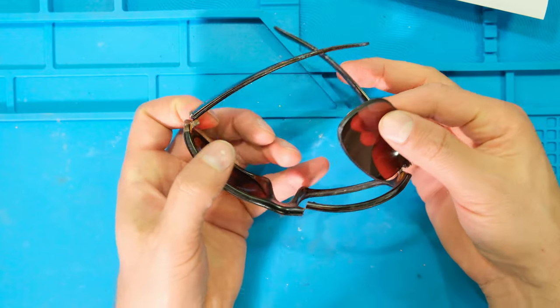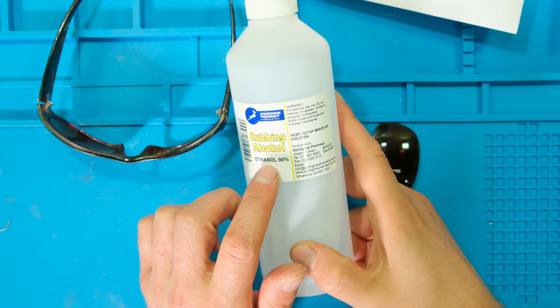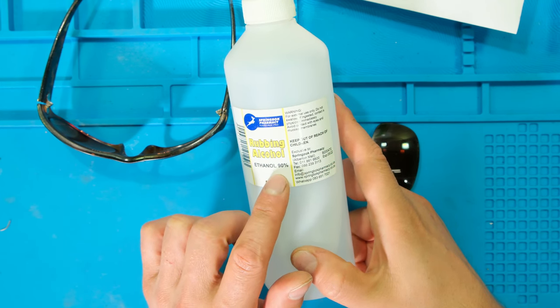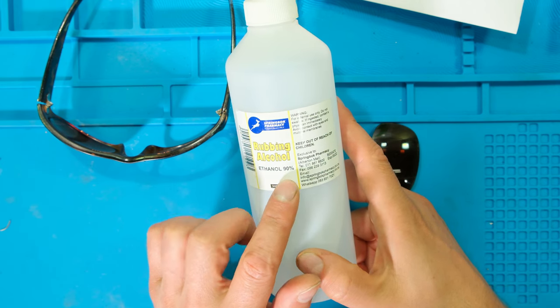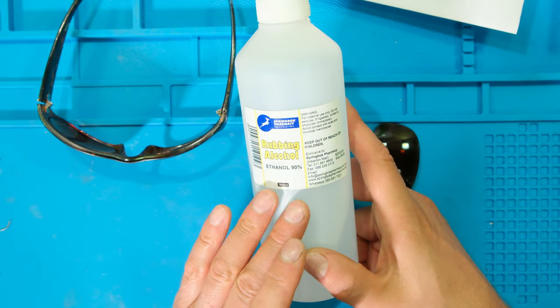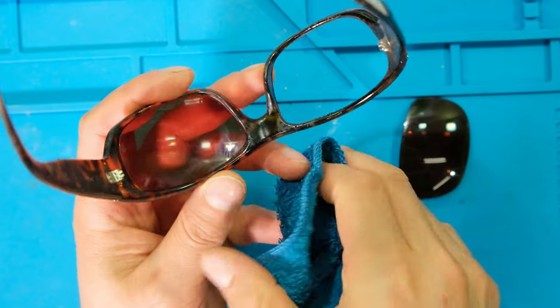The first step is to clean the frames. Since I'm going to be using superglue I need to clean the frame with rubbing alcohol. This is not the same as a hand sanitizer — a hand sanitizer often has glycol in it. This is just alcohol and water so it will not leave any oily residue. I'm going to use this to wipe down the lenses and the frame. There's a lot of makeup on this frame so I'm just going to get it off with alcohol.